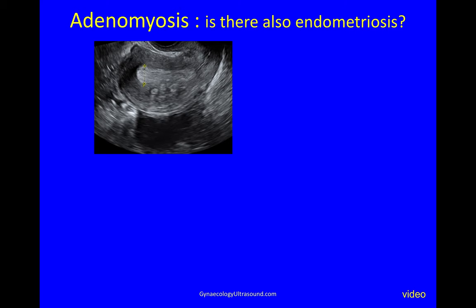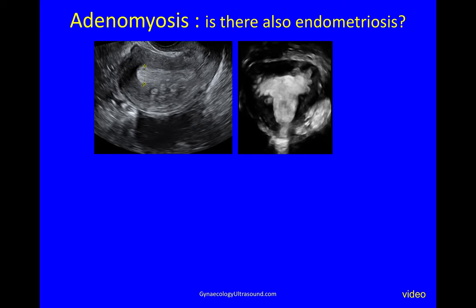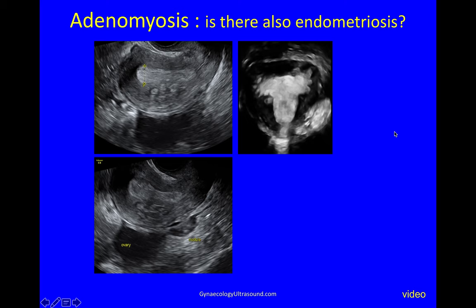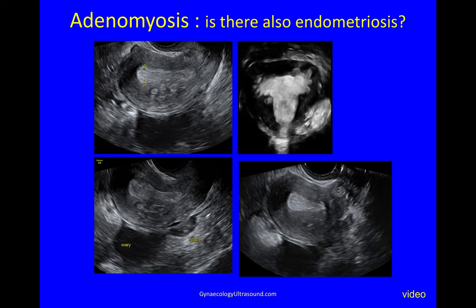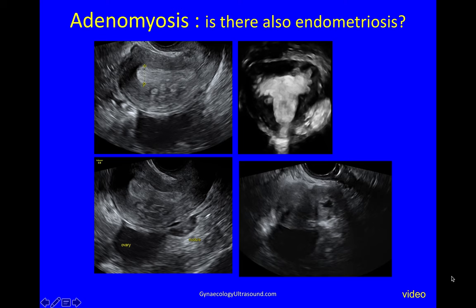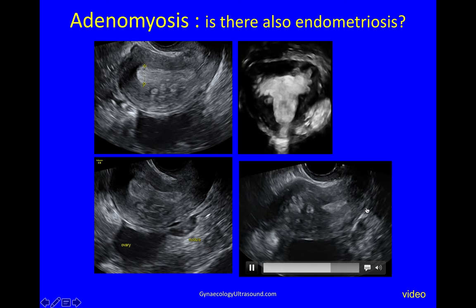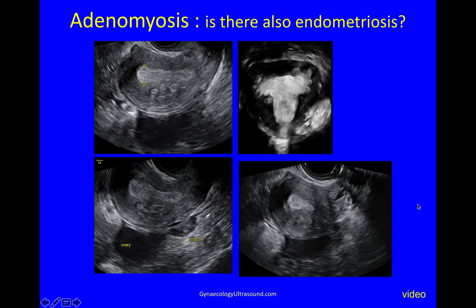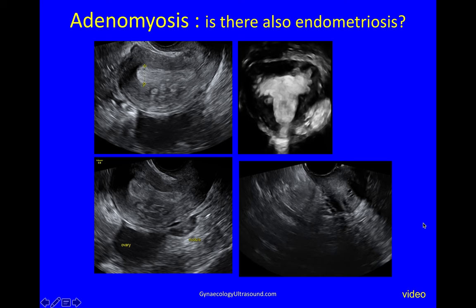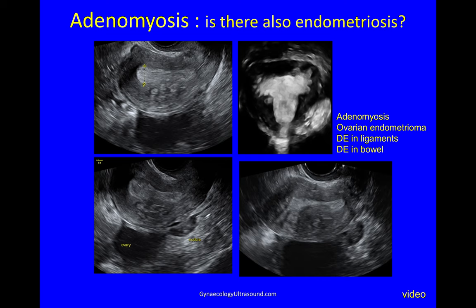In another example, an anteverted uterus in the luteal phase shows islands of endometrium in the myometrium giving a typical budding appearance. On 3D, having diagnosed adenomyosis, you then find the endometriosis: an ovarian endometrioma, a bowel nodule of deep endometriosis, and deep endometriosis in the ligaments at the torus. With this uterus showing really bad adenomyosis, you can see islands of endometrium in the myometrium, the ovarian endometrioma, the bowel nodule, and the ligament deep endometriosis — so it's very useful to look carefully in women with adenomyosis for coexisting endometriosis.